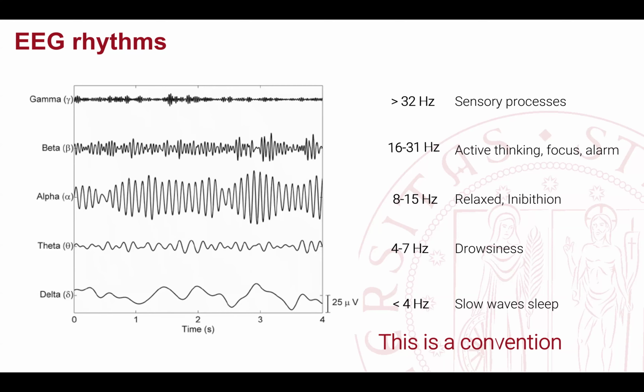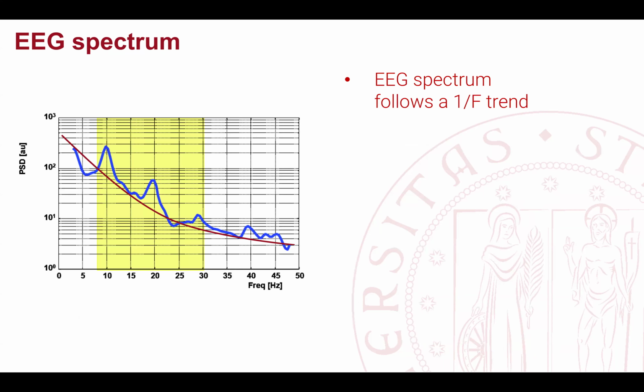My question is, because you showed the curves, and you said we can see at distance the alpha one. But usually they are mixed all together, because they happen in different frequency bands. So what we see actually is always a mix of all components. Yes, always. But the reason why you see this alpha clearly is in this slide.